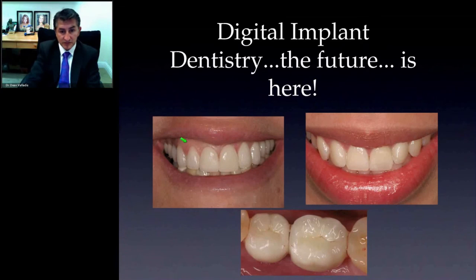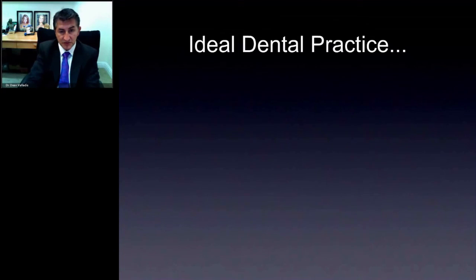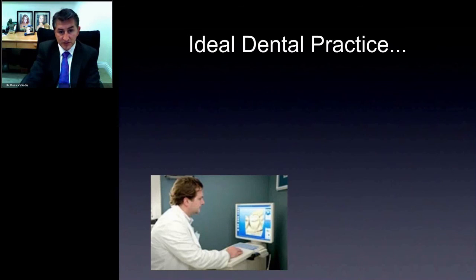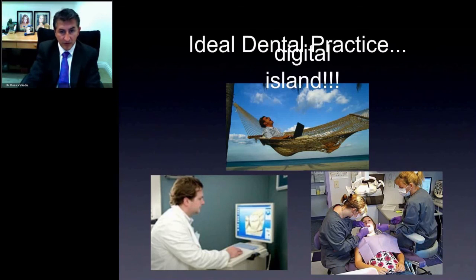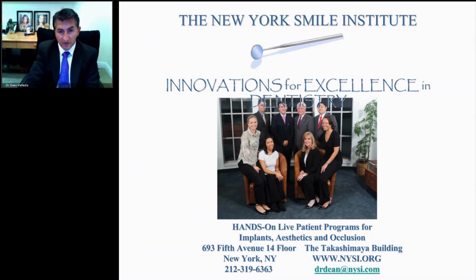We're doing a lot of central incisors, and we can actually match shade a lot better than our technicians because the patient's right there in front of us. The ideal dental practice, well, my vision is to have associates taking the scans and then other people doing their try-ins, and I can be somewhere and just kind of doing my digital designs from afar.